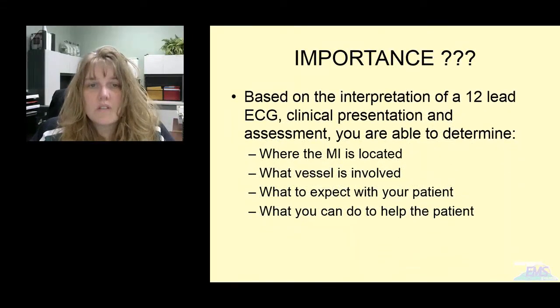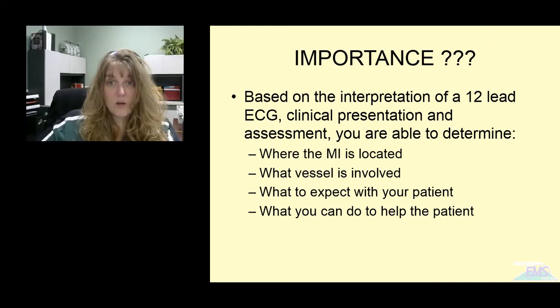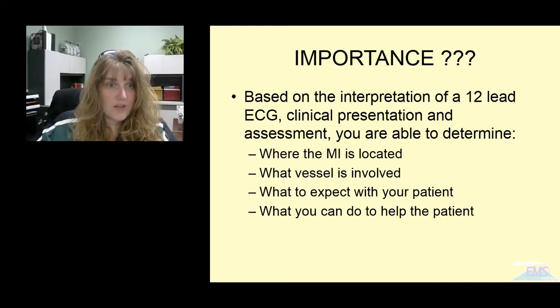So the importance of this is that it gives you the ability to identify where the MI is located and what vessel has been damaged. It'll give you a really good idea of what to expect with your patient and how they're going to present to you, and what you can do to help them or prevent further damage, because some medications are not appropriate in certain situations.